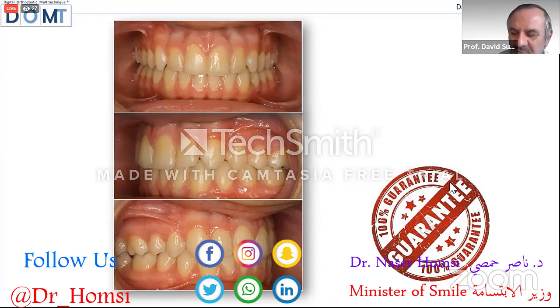The idea is, if you are using, for example, Invisalign, you have Invisalign kits. The idea of Invisalign kits is to do all the treatment of the patient using only aligners. My idea is different. The idea is to put in the first phase of the treatment something very simple: 4 brackets, 1 Quad Helix, 1 lingual arch, and to use only the aligners in the last phase or last part of the mixed dentition, immediately before the exfoliation of the second temporary molars and before the eruption of the upper canine.